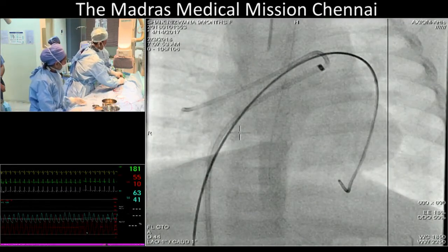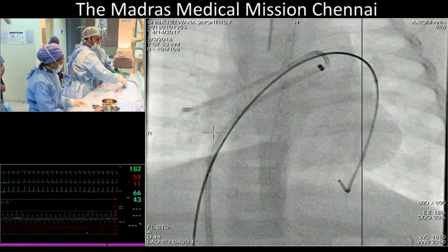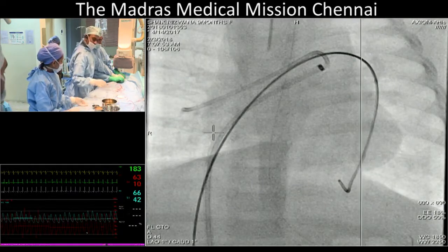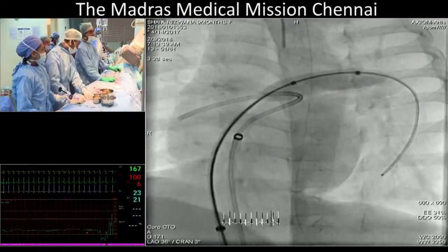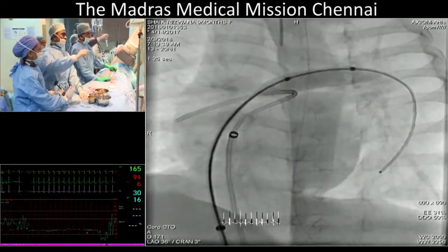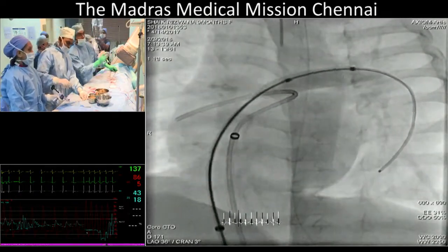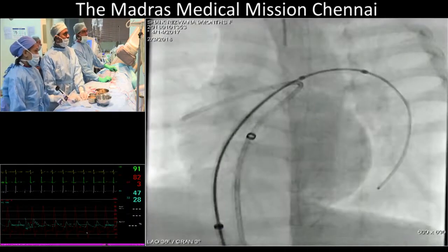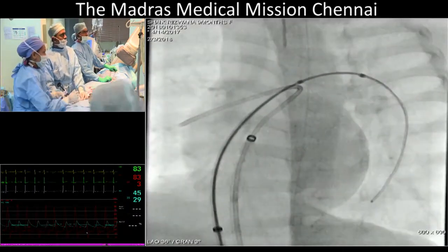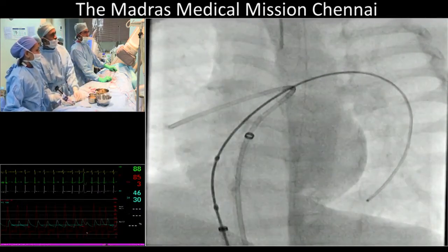Yeah, sure. All right. So let's go back to Tin. This is good fun, isn't it? Backwards and forwards. Hello, Siva. Hi. So Shiva, we're back with you. So we will now show you deflate. We are now ballooning the left. What balloon have you got? Same Mustang.